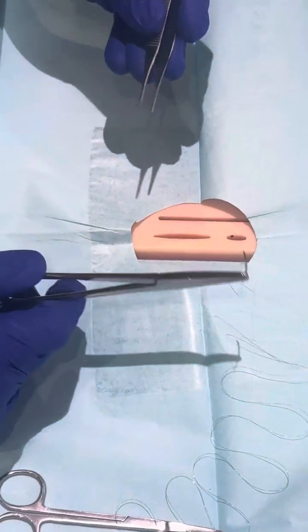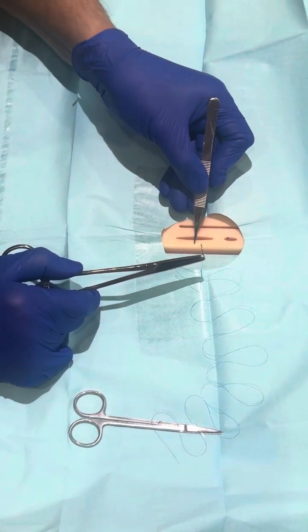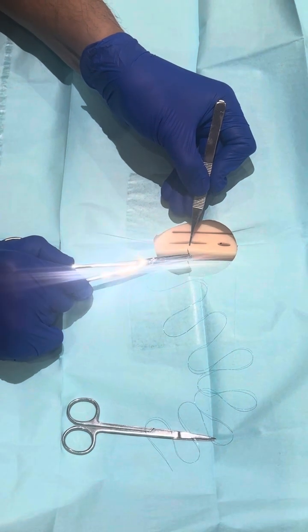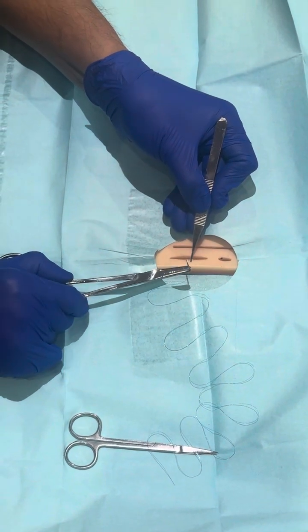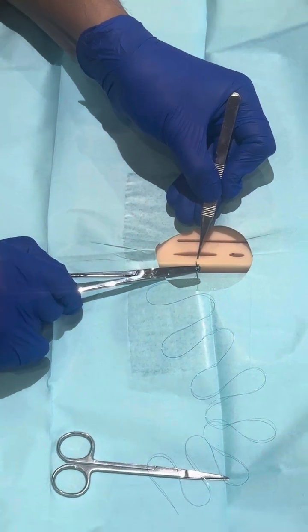And then when you're starting to suture, start first at the middle of the wound, and approximately the bite is around 1 centimeter or less when you introduce the needle. It has to be the same on the other side also.